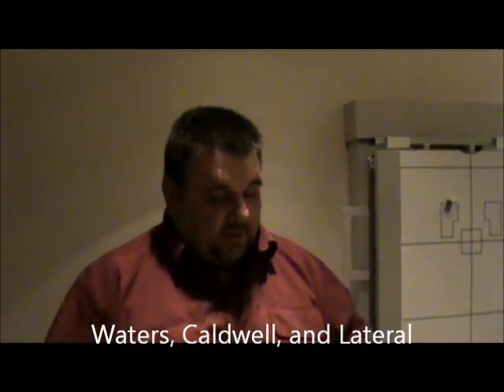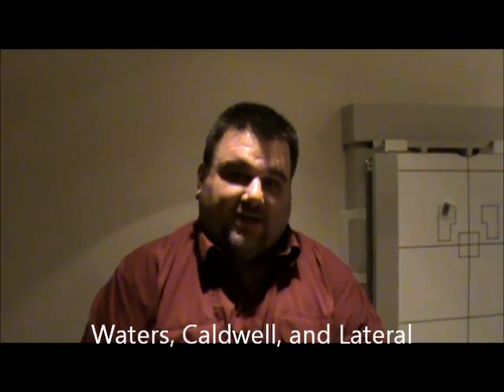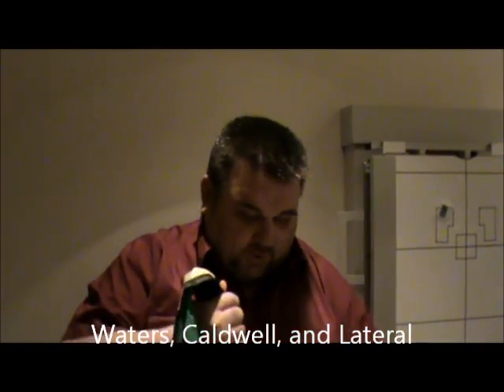Today we're going to be demonstrating our sinus x-rays. The routine views for sinuses will be Waters, Caldwell, and lateral. The lateral will be of the site of interest.